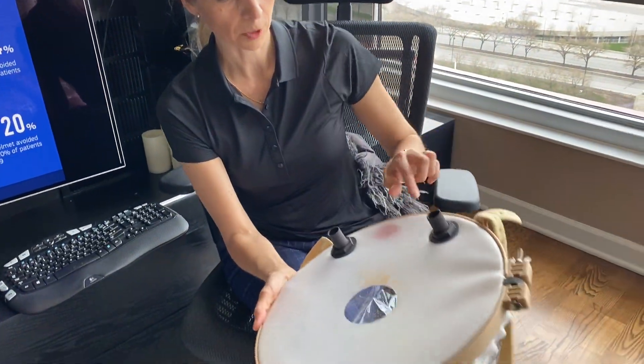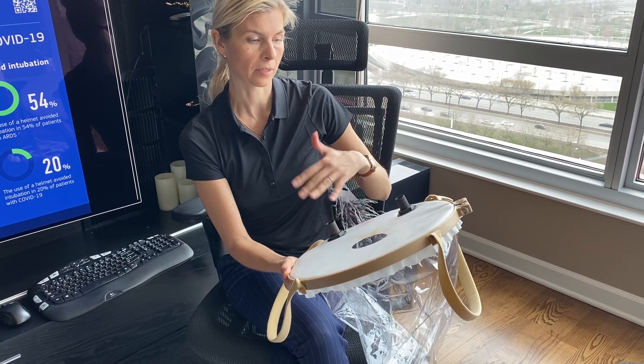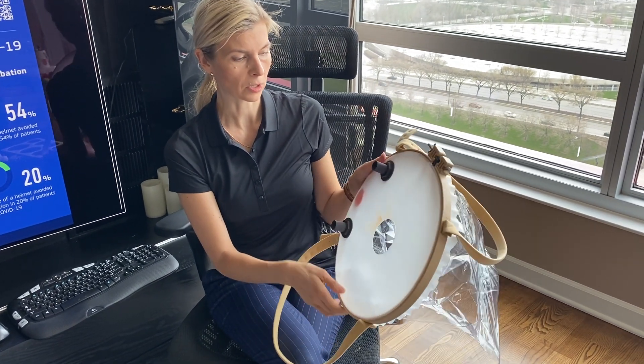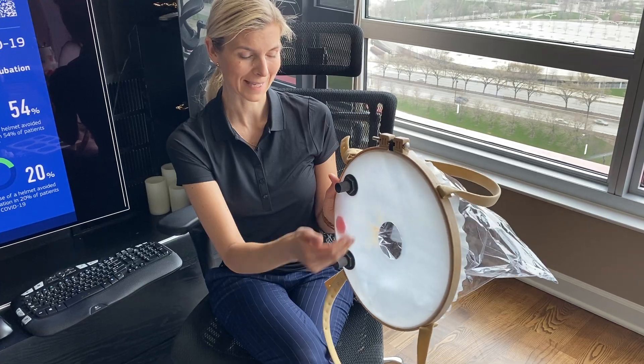Before putting it on, I want to mention that this part can be changed. So if you use it for the patient and for some reason it's torn or something, you can always get only this part from the company, and as you can see, it's pretty easy to replace it.